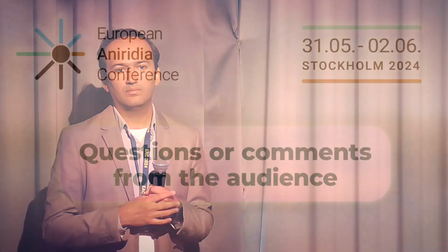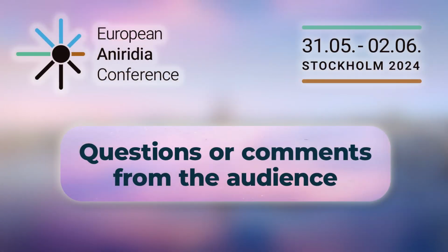And do you think for the same reason that maybe the patient is not as dependent on the artificial teardrops? Do you think that an aniridic patient, if one uses the lens that you showed, maybe does not need to drop these artificial drops as often as is usually needed, or? That could be one of the benefits, because we see this in patients with dry eyes as well. But in case it is needed, do you think that one can drop these artificial tears at the same time as the lens is in place?